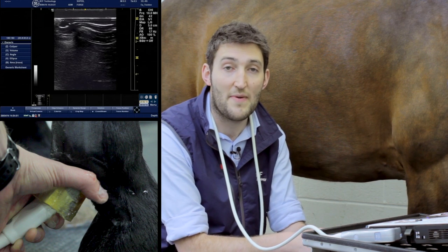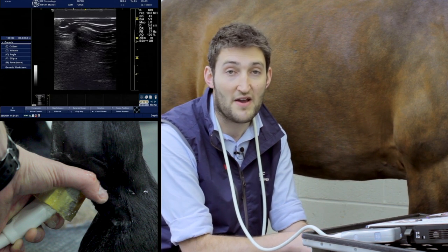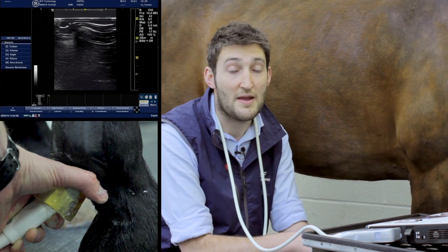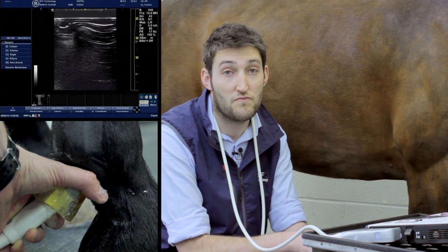In much the same way, the pastern is subdivided down into zones, though in the pastern, convention tends to go with zones 1A, 1B, and 1C, and then zone 2, 2A.